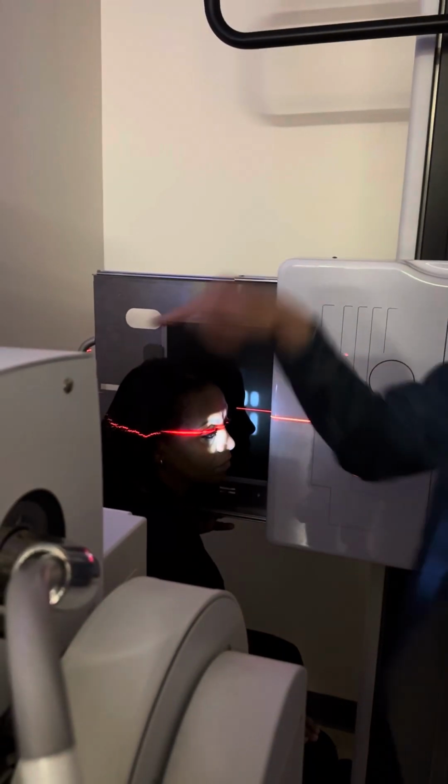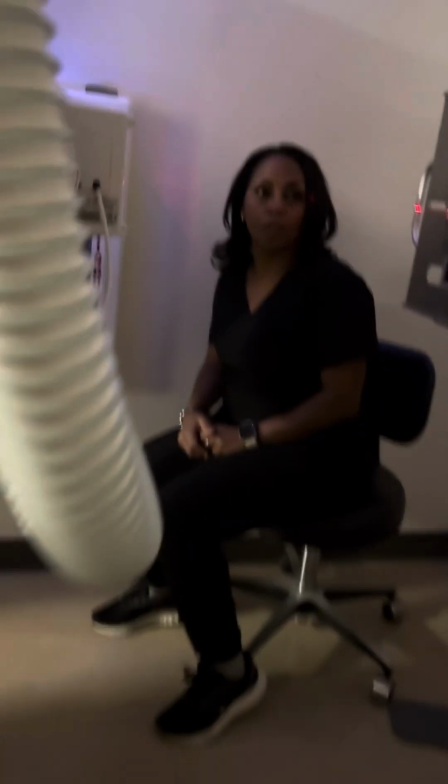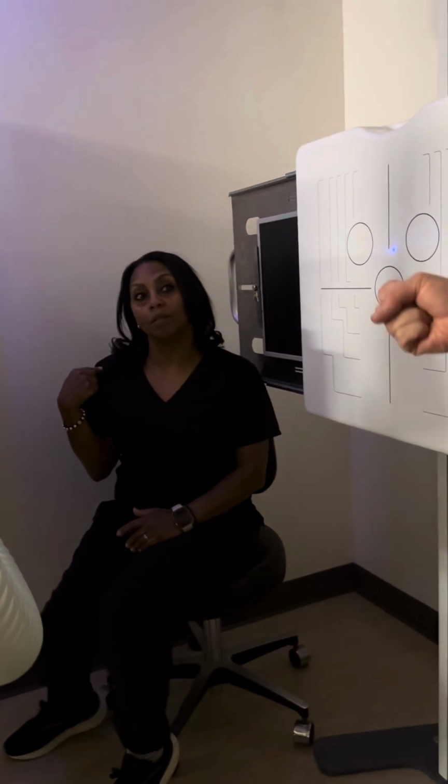If I drop the central ray, it'll be at the IOML that I'm setting her up, and then I'm bringing it up to the bridge of the nose. Okay. Go ahead and relax for me. Thank you. So I was able to do her with the right. I'm not sure I'll be able to get the left. You're welcome to try it and or take it to the Bucky device, and you'll have better range with it.